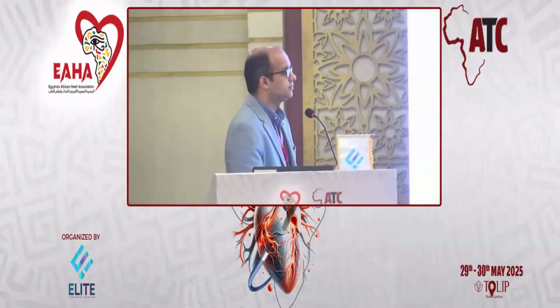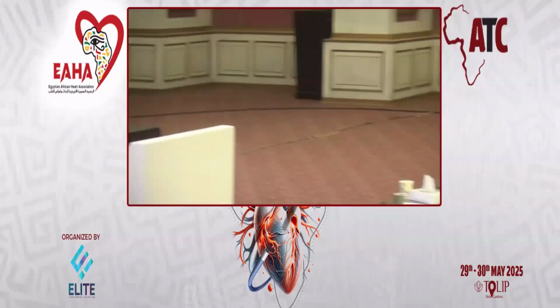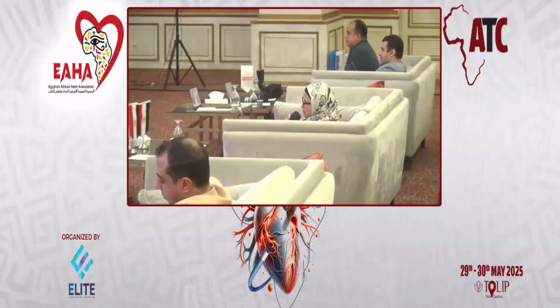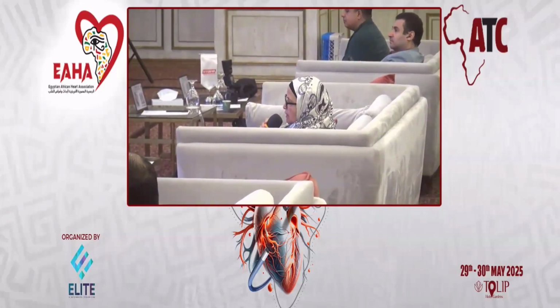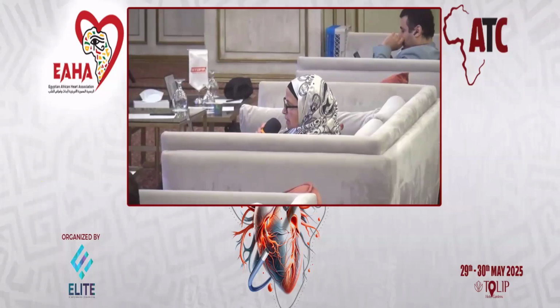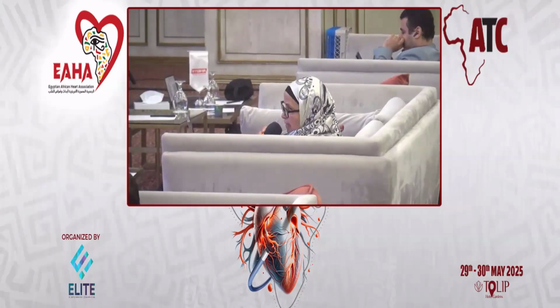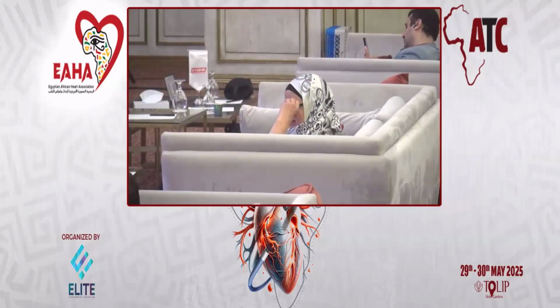Okay. I have a question from the chat of the audience online, who are 38 now. The question from Dr. Ahmad Ramadan, for you and Musalami, anyone can answer. He is speaking about a current patient under his service, a patient with paroxysmal atrial fibrillation and wide complex tachycardia. He is receiving multiple shocks. What is your strategy? The same question Dr. John asked.